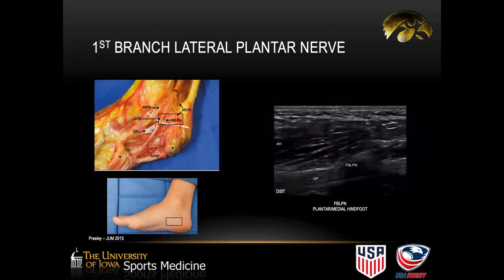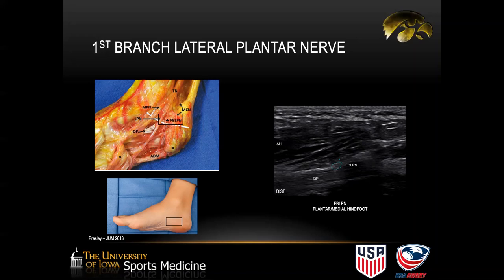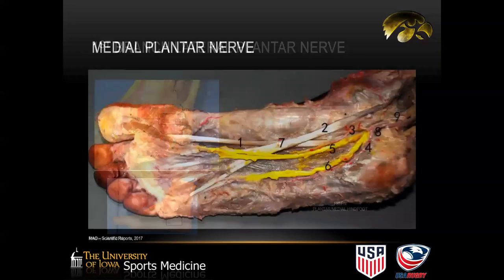Next I'll target two of these nerves and follow them distally to specific entrapment points that cause plantar heel and foot pain. One of the most common is Baxter's nerve — the first branch of the lateral plantar nerve. I'll follow it distally until I see it at the interval between the abductor hallucis and quadratus plantae, looking for focal compression. Pain with sonopalpation is also helpful in identifying this as the culprit. In this patient, the first branch lateral plantar nerve was normal with no pain on sonopalpation over this region.